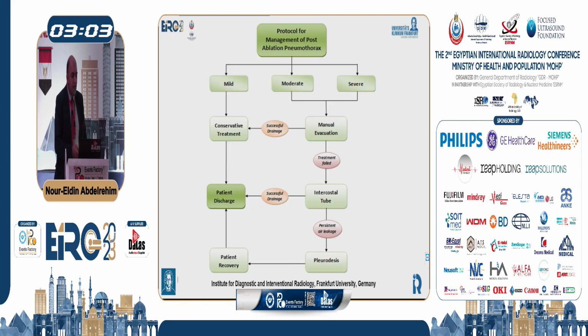So the protocol that we use for the management of pneumothorax is that as long as the pneumothorax is mild and minimal, less than 2 centimeters on CT, you do not need to intervene. Just follow up the case after 2 hours. If it is not increasing, no management is required.